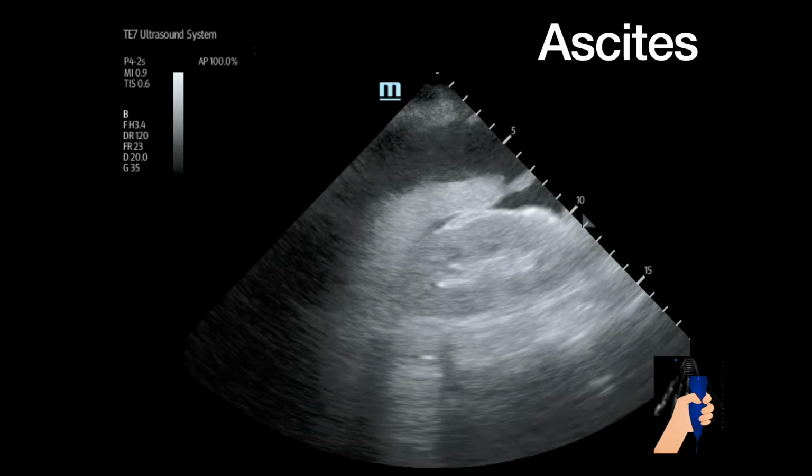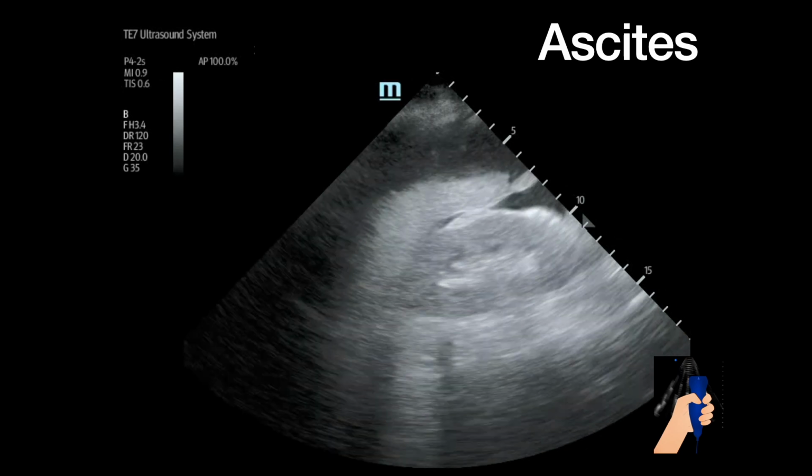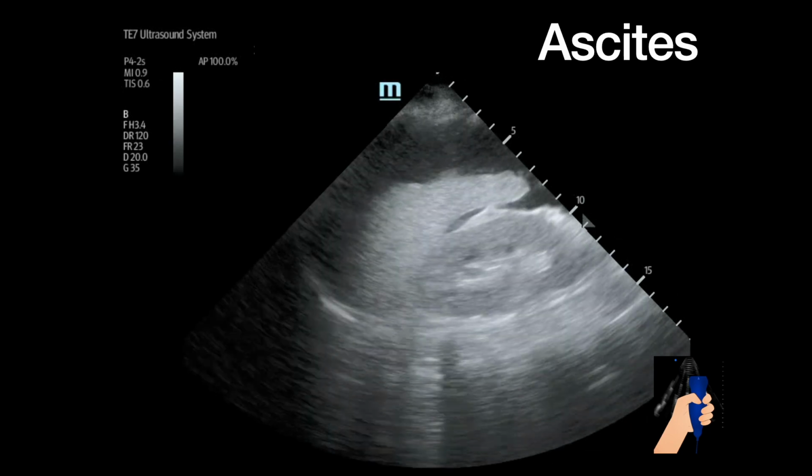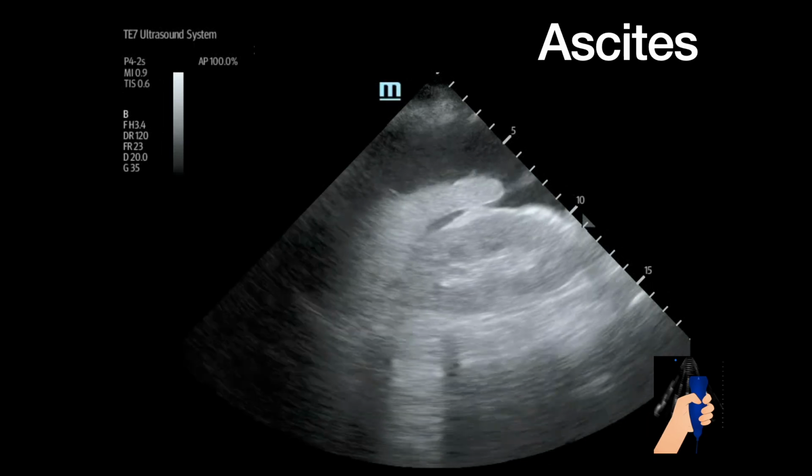In this series of videos, we will see ascites. Ascites is an easy diagnosis with point-of-care ultrasound. Small amounts of fluid can be detected.